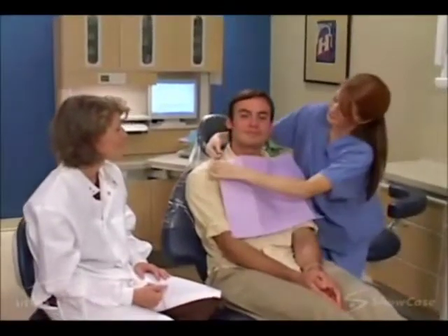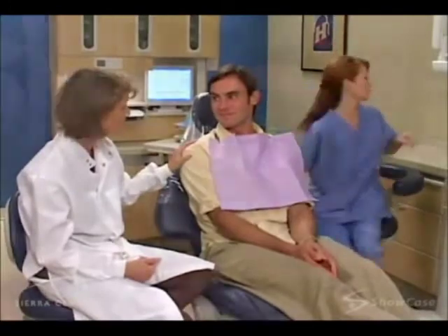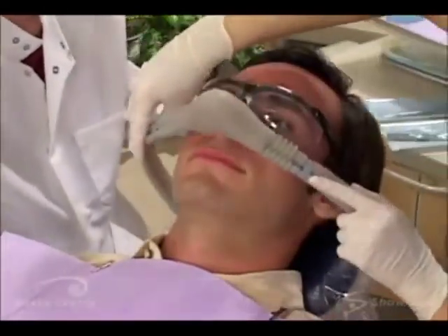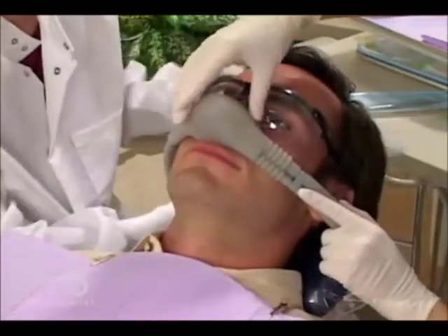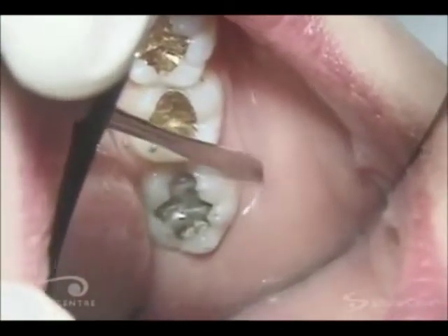Removing a tooth is sometimes necessary to treat pain and preserve the health of your mouth. Before the procedure, we may offer nitrous oxide gas to relax you, and we'll numb the area to make you comfortable. After a while, we check the area to make sure that you're completely numb.